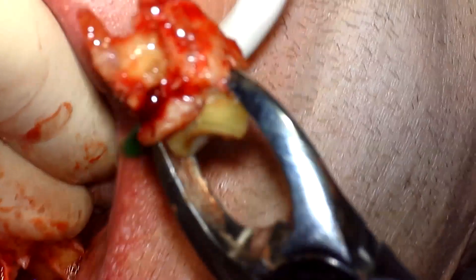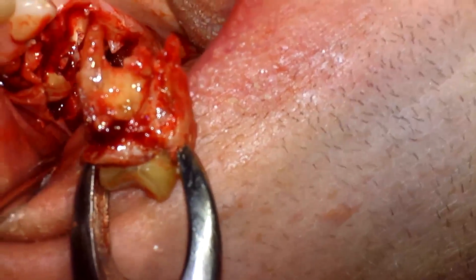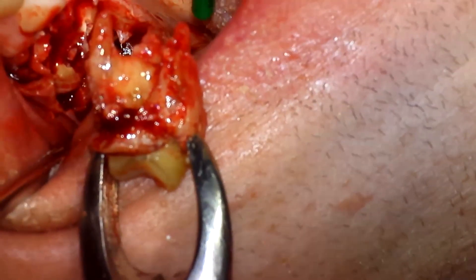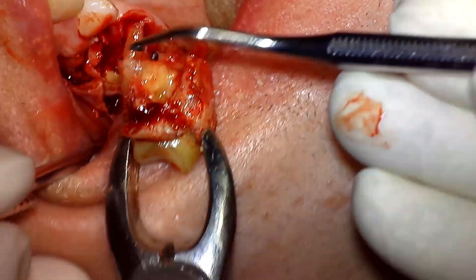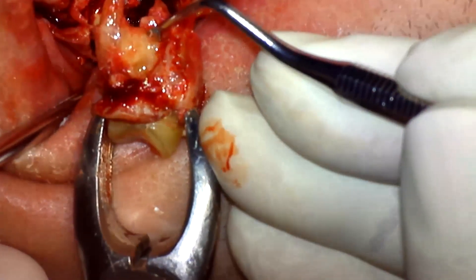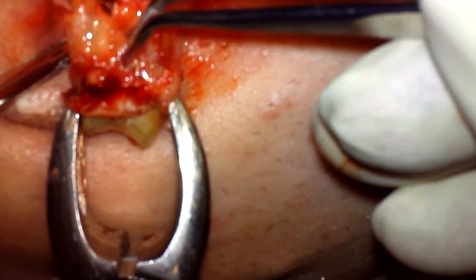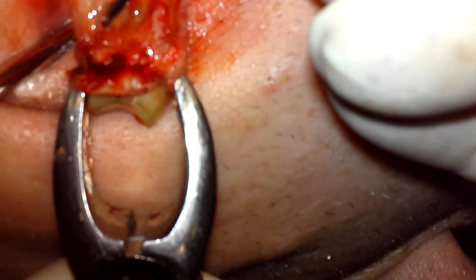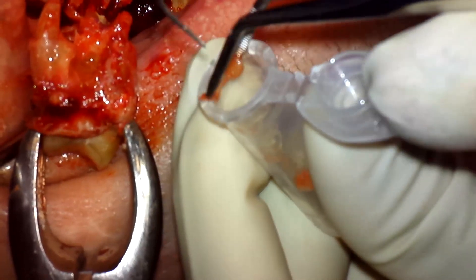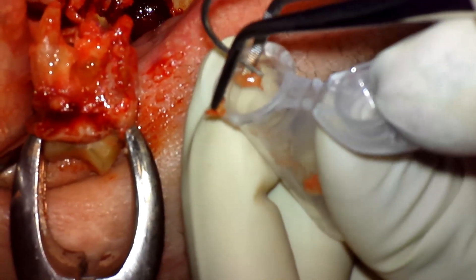The video starts with the extraction of tooth 1-8. Fatty degeneration between the roots is clearly evident. A sharp spoon scrapes out the fatty degeneration. A fat sample is taken with tweezers and submitted for histological examination. Additional fat samples are submitted to the laboratory and tubes for lab analysis of RANTES expression.